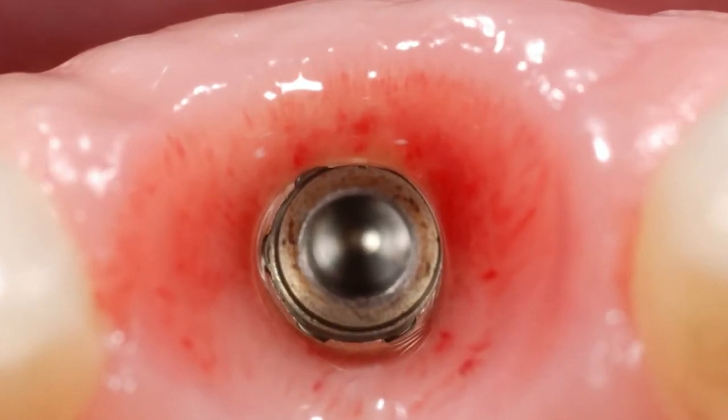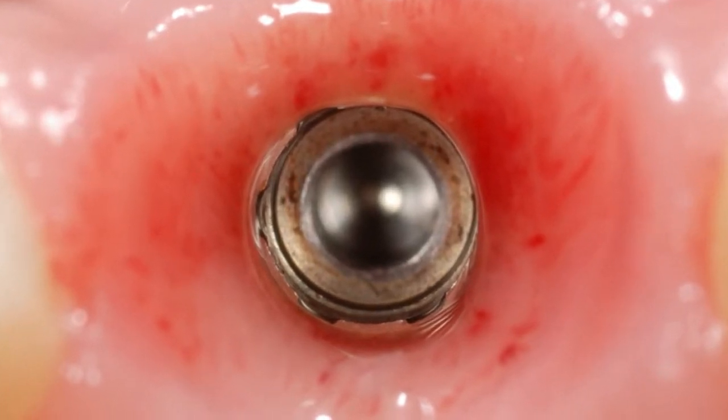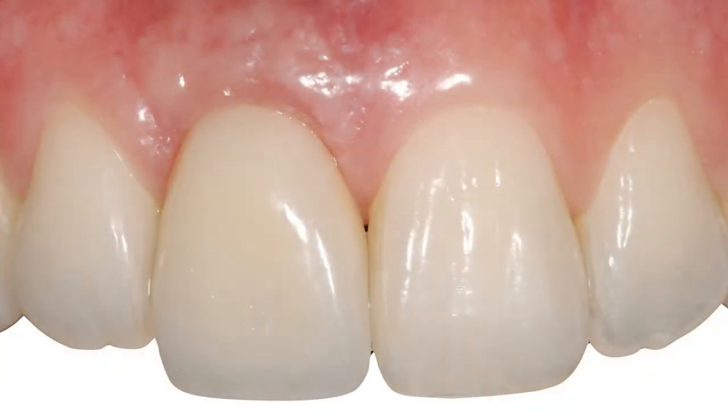Then I reconstruct the convexity of the neighboring central incisor, and this thickness is very important because we do know today that this is going to influence the stability of the peri-implant bone maintenance. Then I deliver the zirconia abutment, and that's the final restoration, full ceramic final restoration. So we are thinking about improving the self-confidence, a key word used by Osstell all the time, and it's something that I use myself all the time.